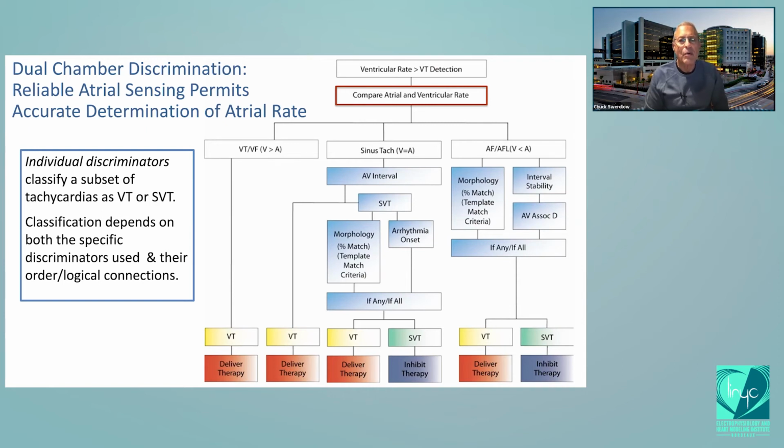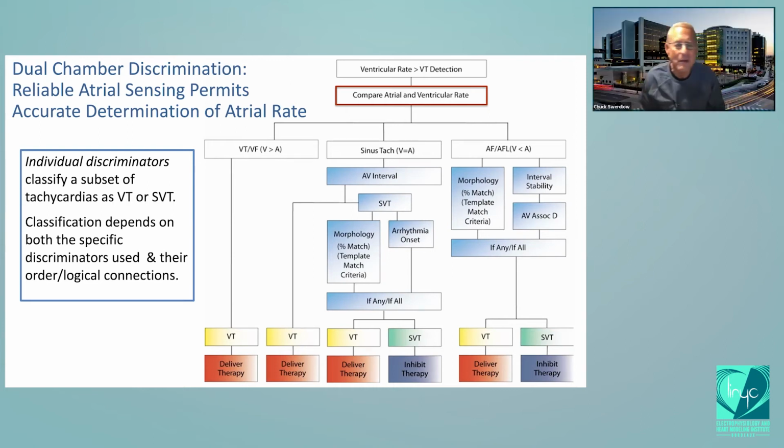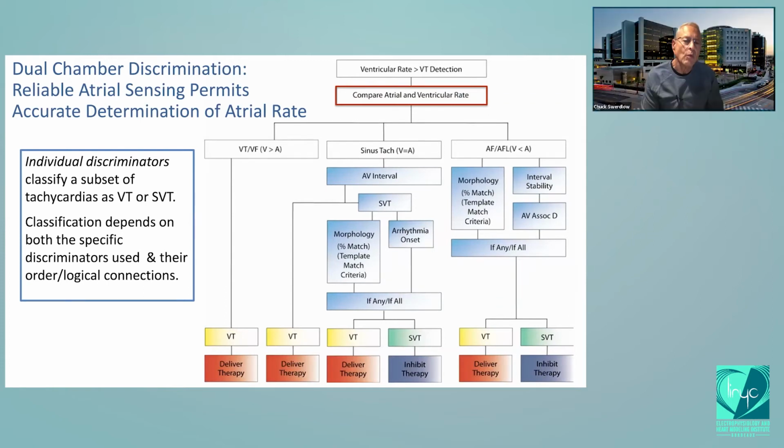another key point. Medtronic sometimes gives me chest pain if I look at the wavelet at work. I'm sorry, Mark, say that again, please. You must agree that if we look at Medtronic decisions, sometimes it gives you a bit of chest pain looking at the wavelet at work. If we look at the correlation in our heads, it's better than 70%, but still it's making this decision that it doesn't match. Wavelet was a great algorithm.